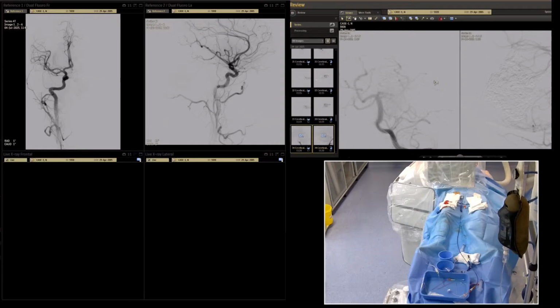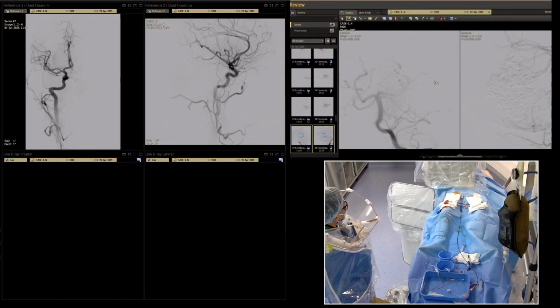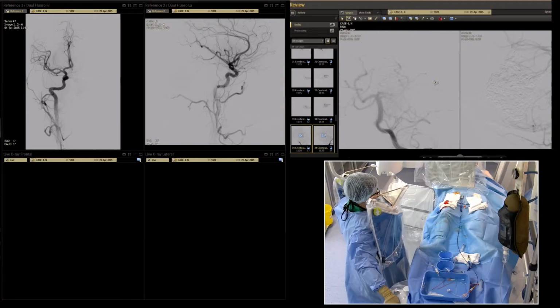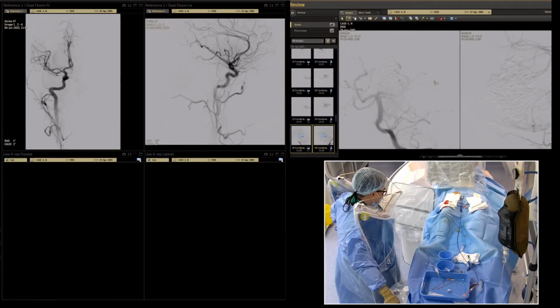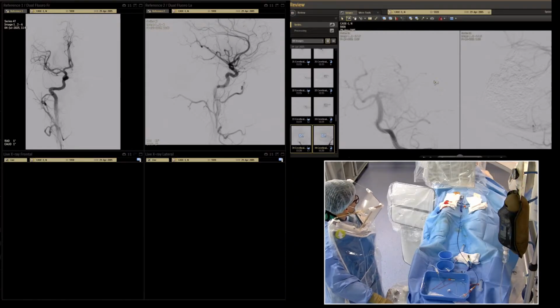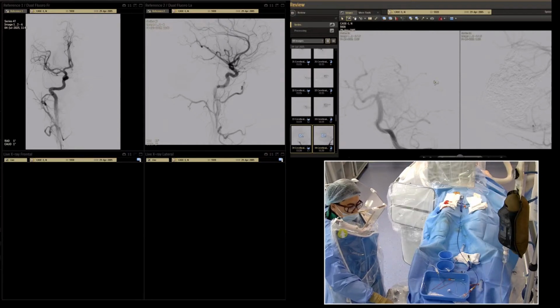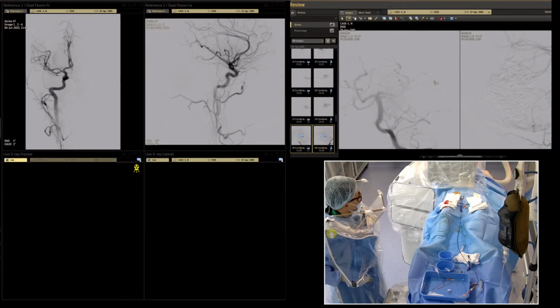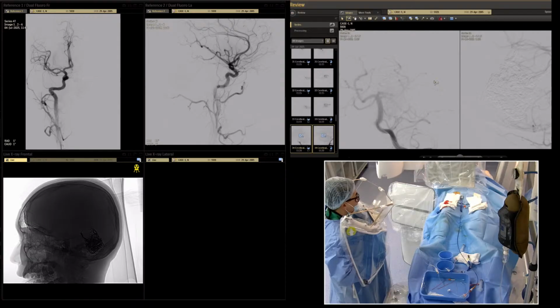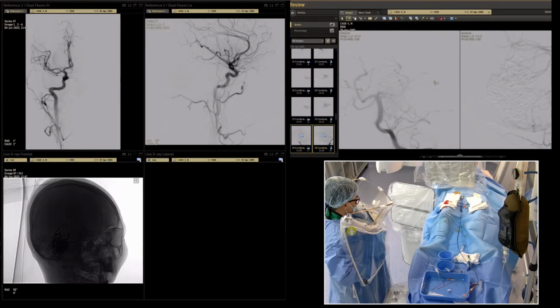Okay, I think the CT is ready. No, it is not yet ready. Yes, CT is not working. Now Rawan should do it from the Andrew suite, and we called the Philips engineers to fix this problem. The button from the operating room is not working anymore. It's working, but from time to time. That's a big problem, huh?